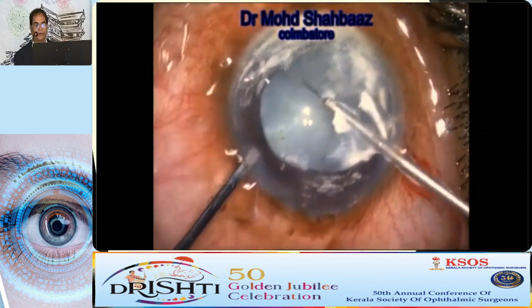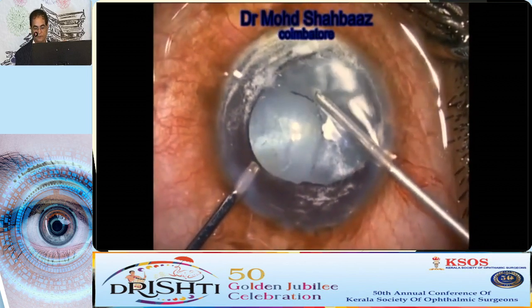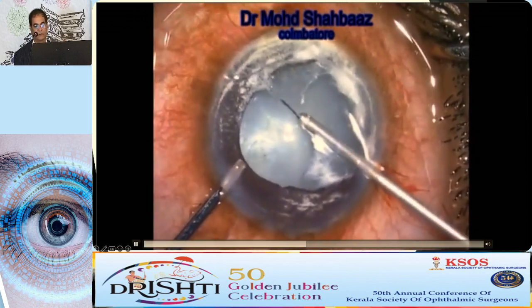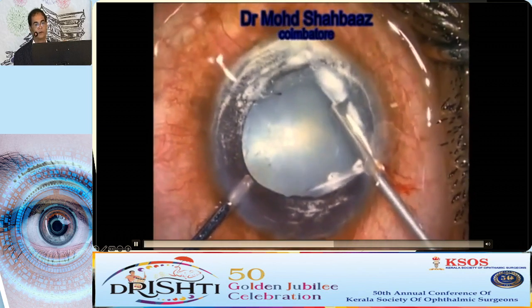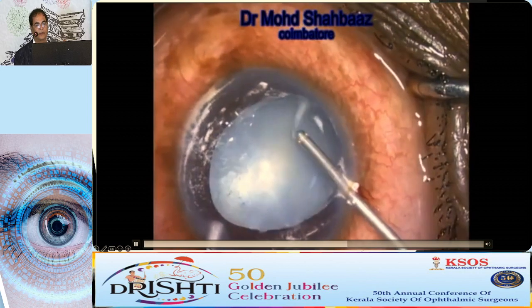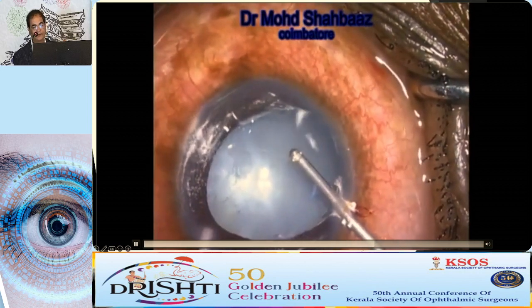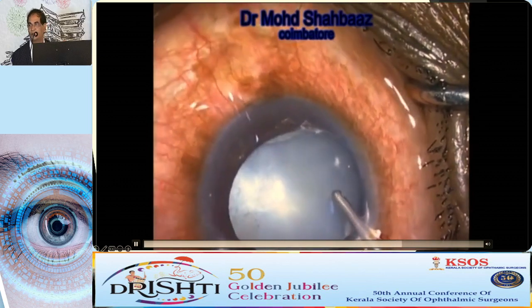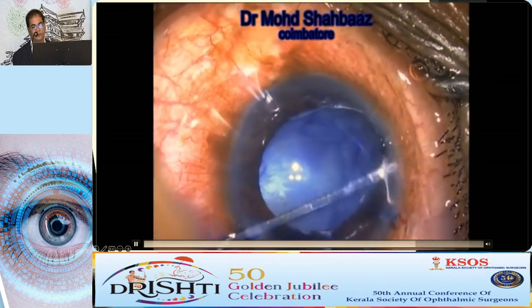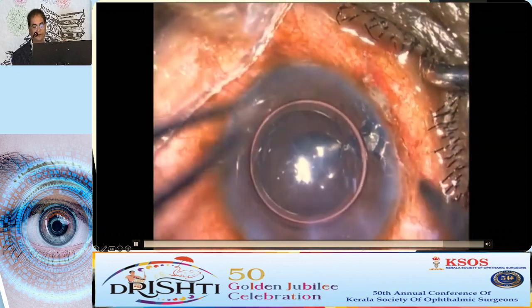Now we have to do the vitrectomy again. Here at the end, you can see some vitreous fibers incarcerated in your side ports. It does happen most of the time. So you have to use a spatula, bring it to the center, and do additional vitrectomy.